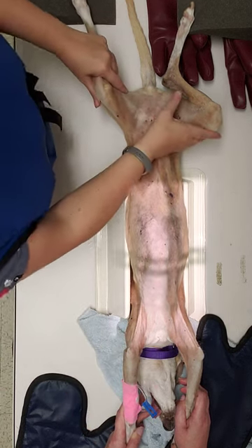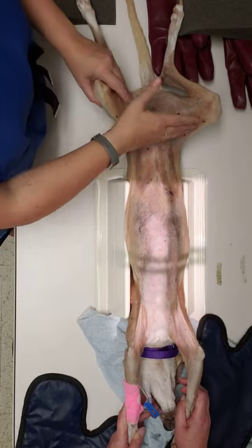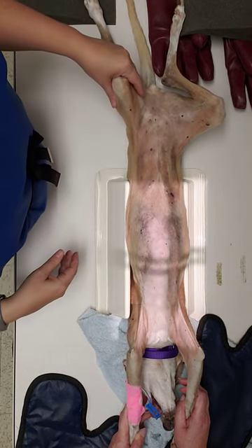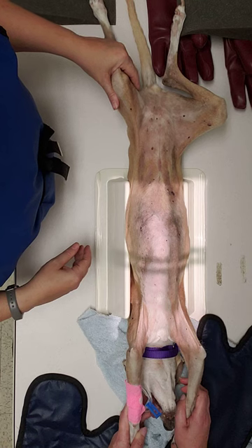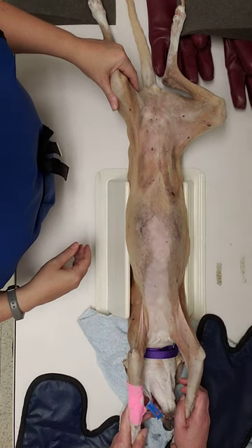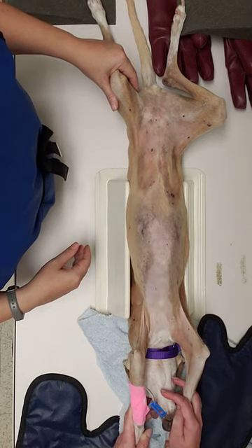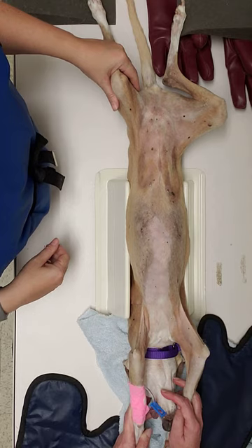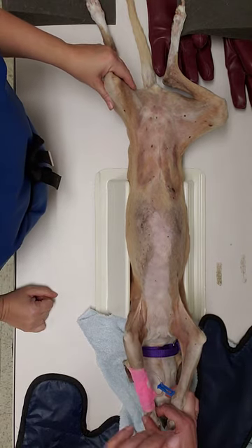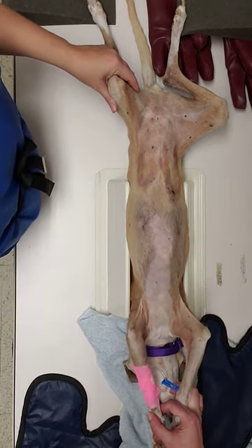You're going to extend the back legs out just a little bit — it's not as drastic as with the abdomen. And you're going to take this radiograph on full inspiration. That is your positioning and collimation for your VD thorax.